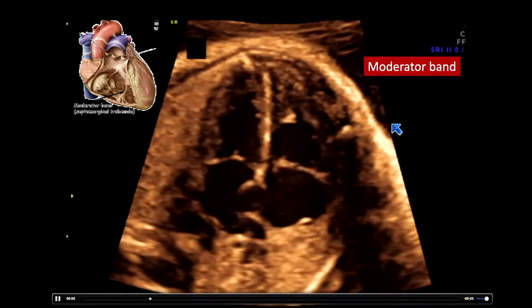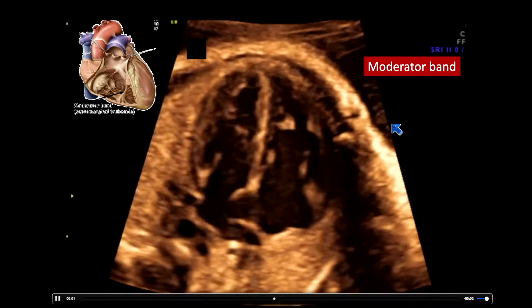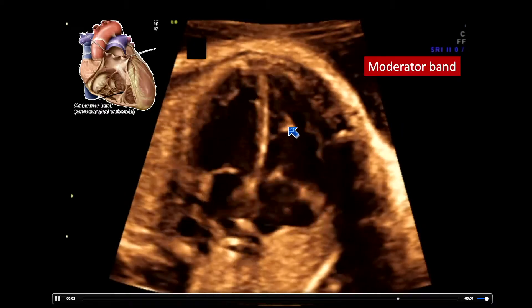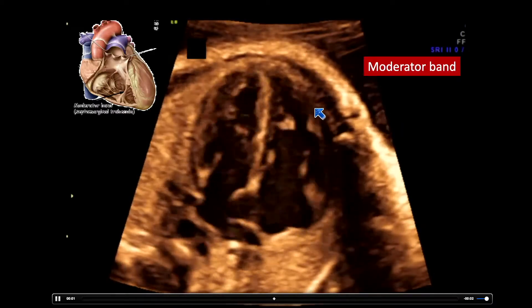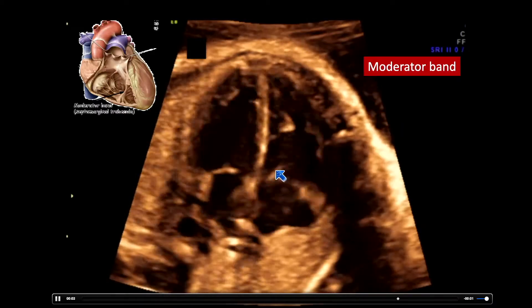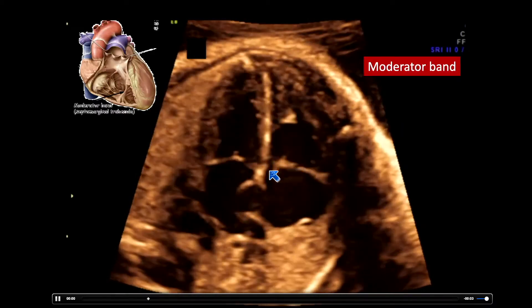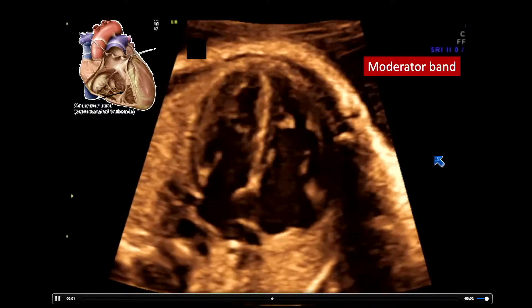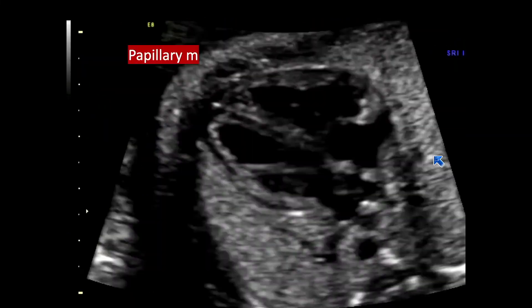In some cases, it's more prominent than in others. But for a right ventricle, train yourself: apically offset AV valve, moderator band.